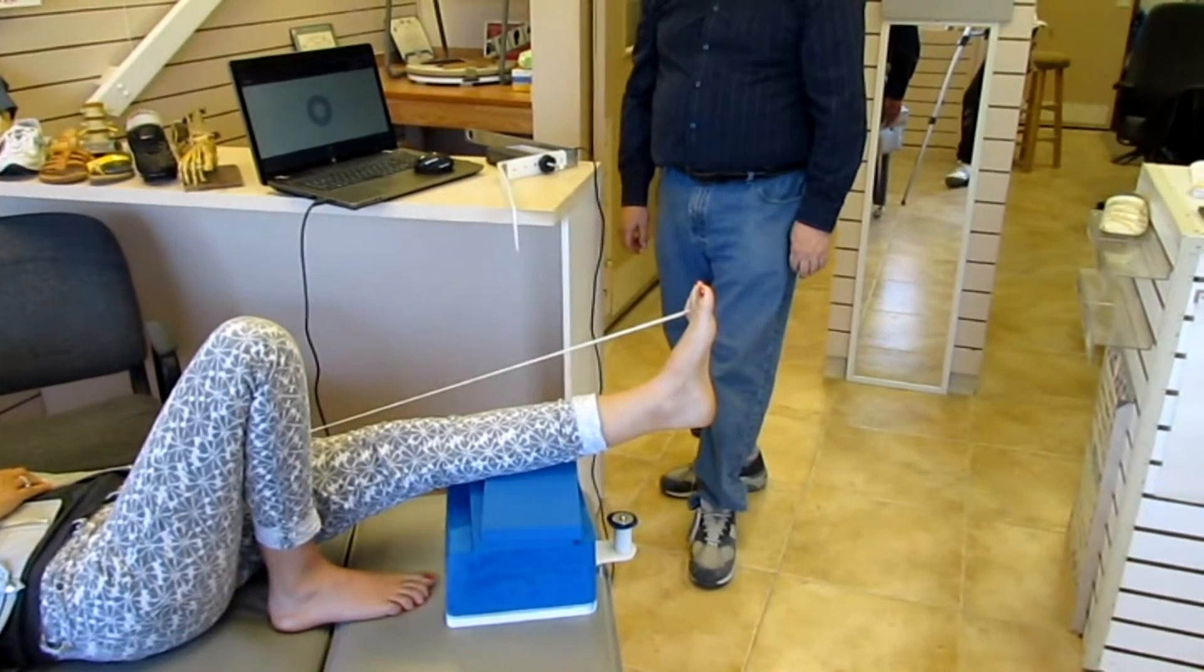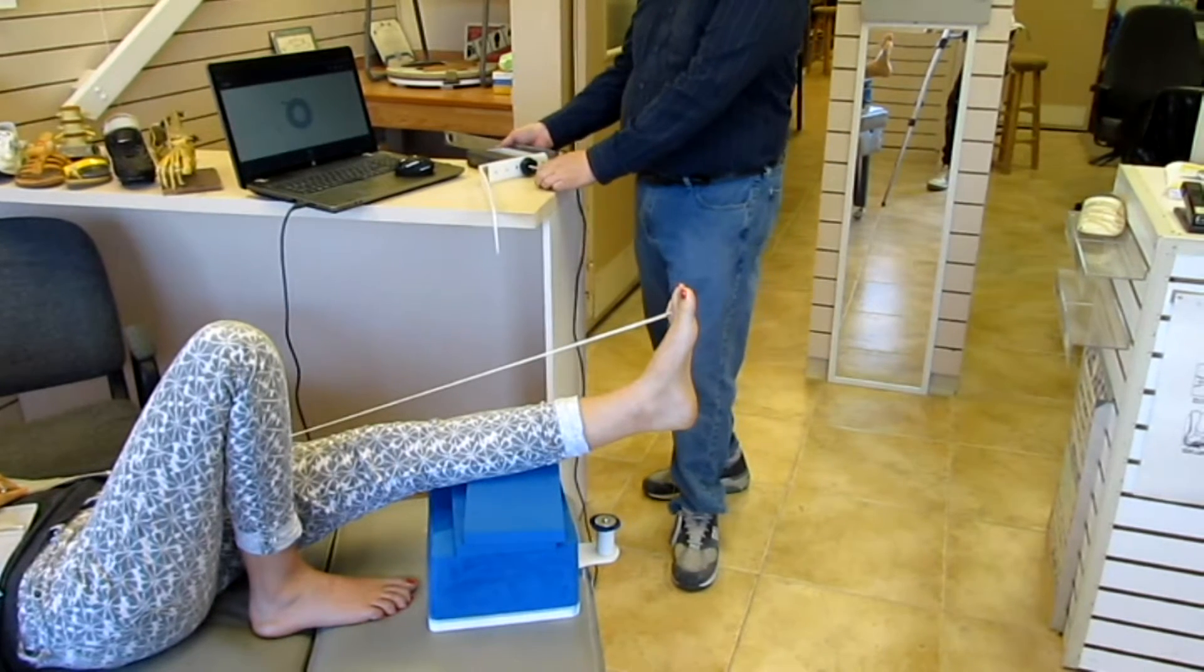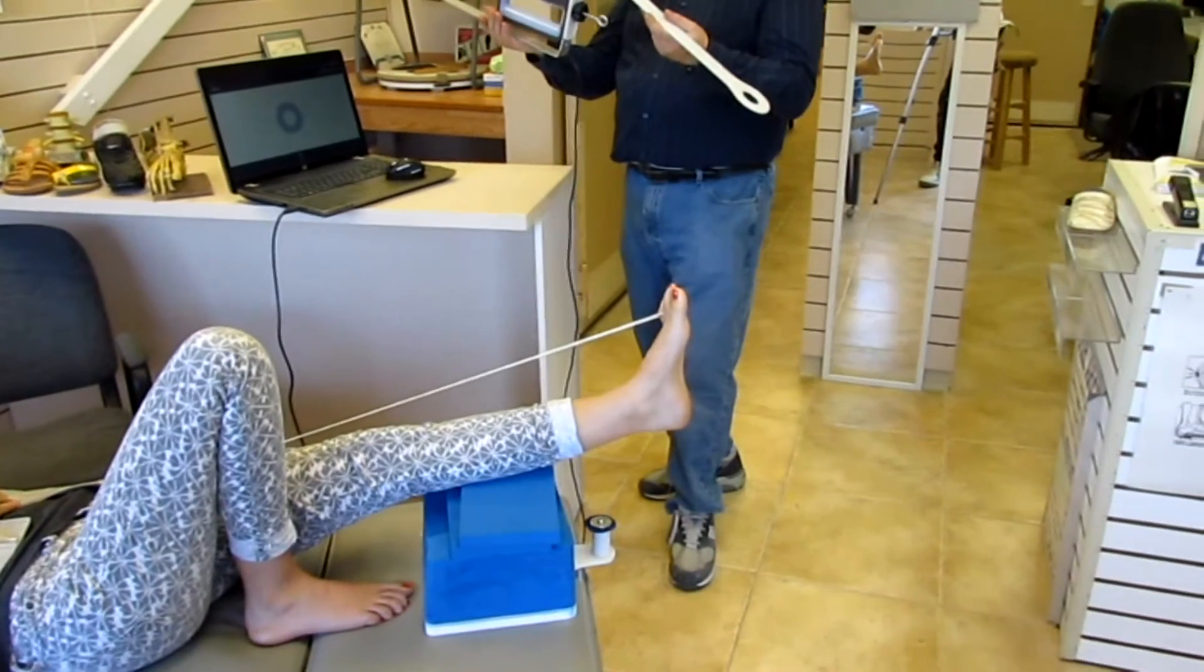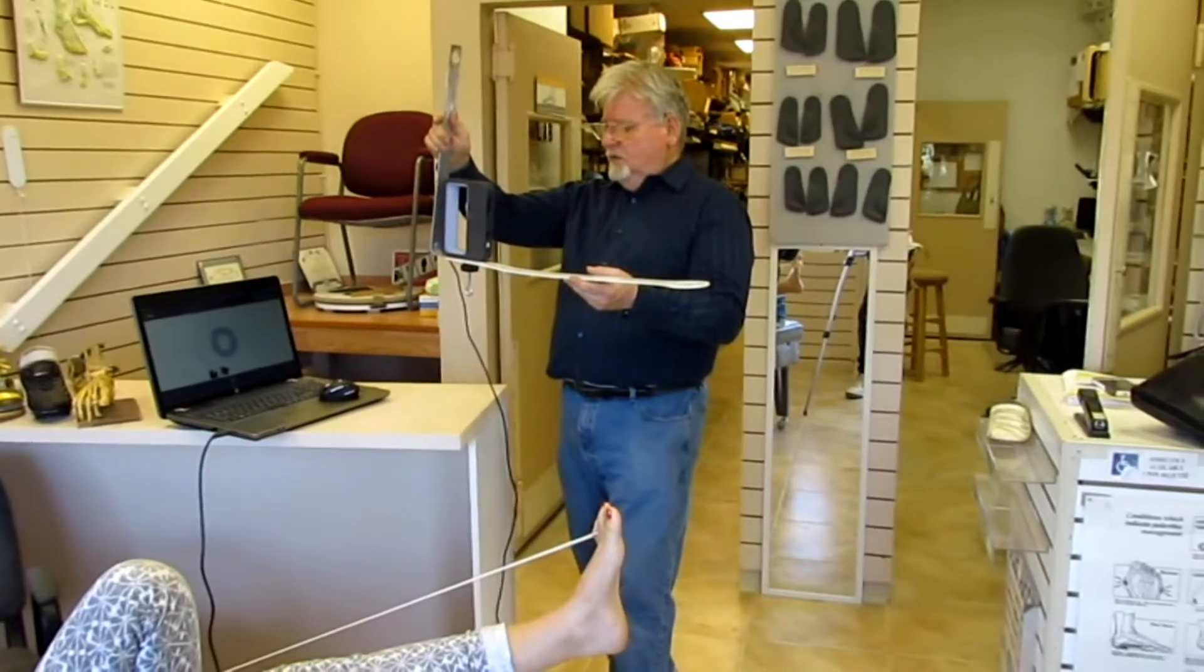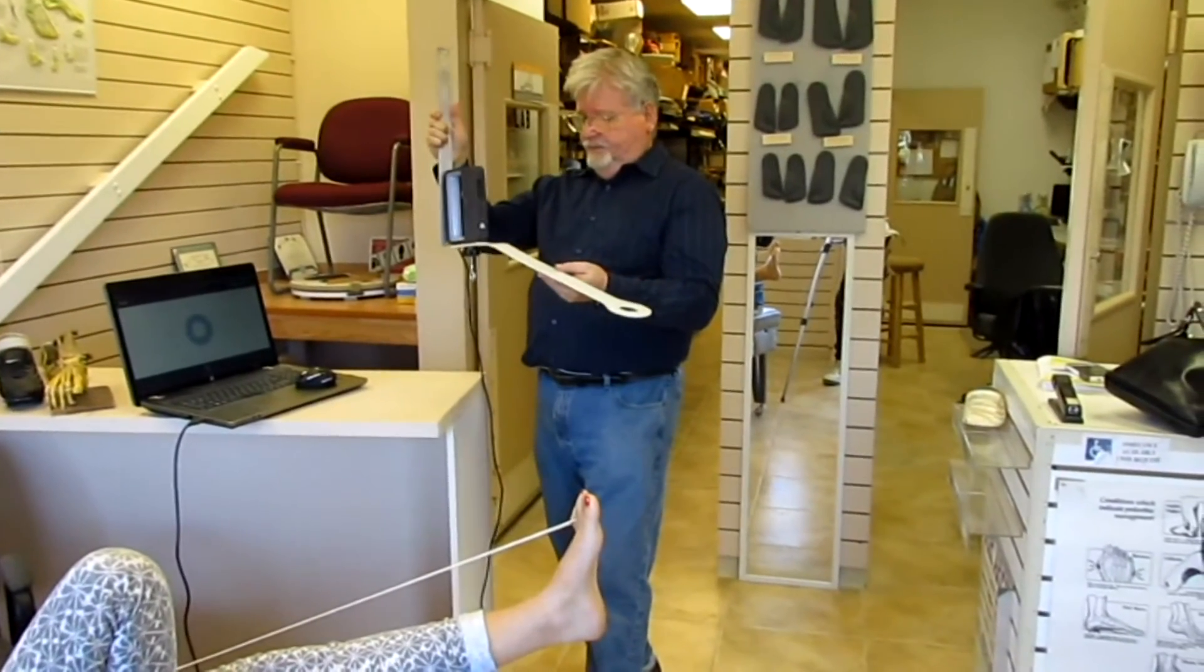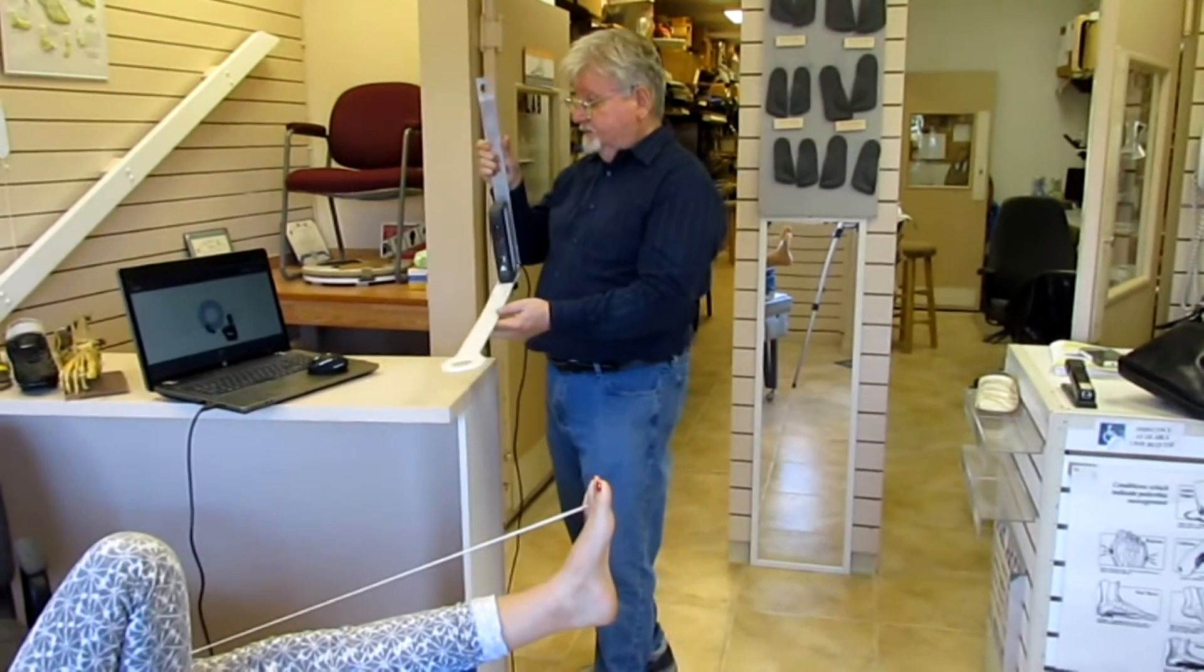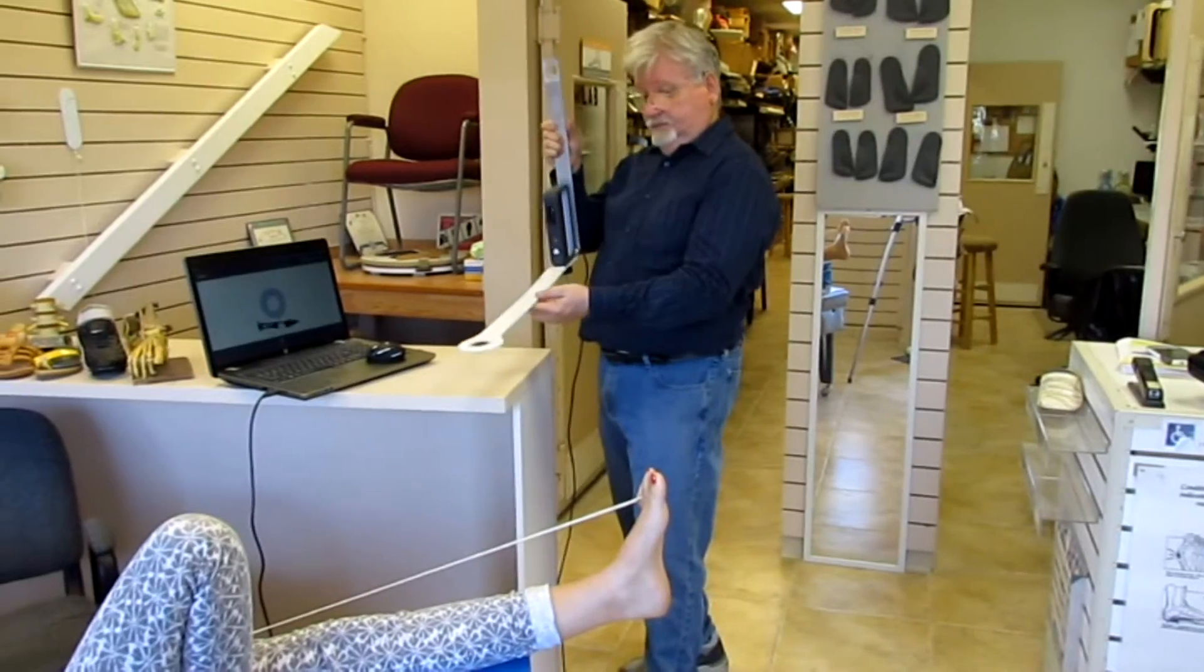Mr. Arch now is going to pick up the foot 3D scanning device, which you can purchase at Staples or Amazon for about $400. It has a flexible arm put on a hinge so that we can lower the scanning device down to the bottom of the heel, up and around the toes, and get the most perfect picture of the foot while moving it around on a pivot point.